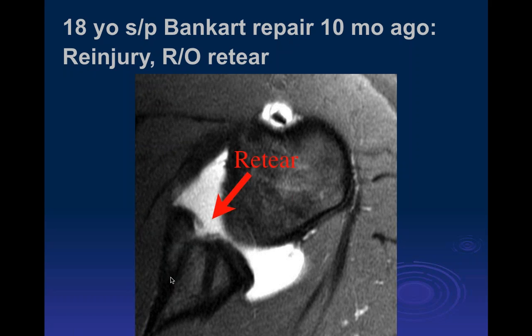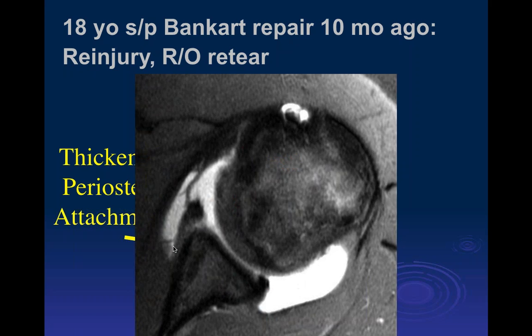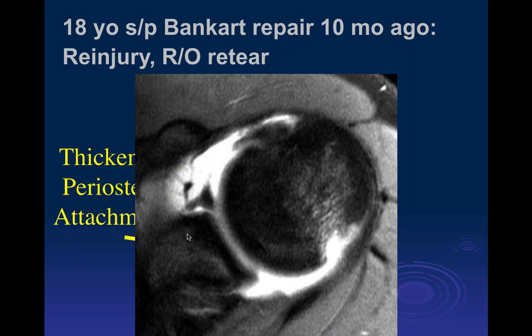Yeah, you'd need to look at the T1 weighted image. That's markedly thickened periosteum here. And that's where the suture anchor is. Here's the next cut where we can see displacement of the labrum, thickening of the periosteum. So this is one of those thickened Perthes-type lesions. Another suture anchor here, but this is clearly re-torn after the surgery. The tear extends up close to the superior area. And we can see an acute Hill-Sachs lesion here with bone marrow edema associated with it.